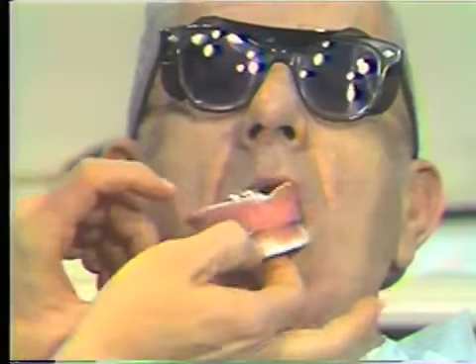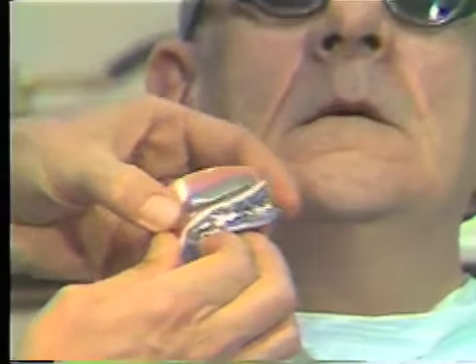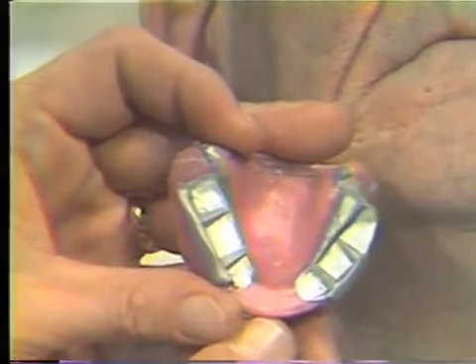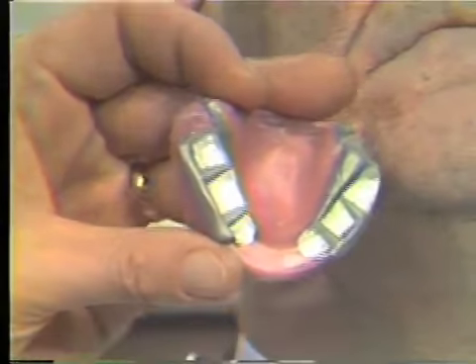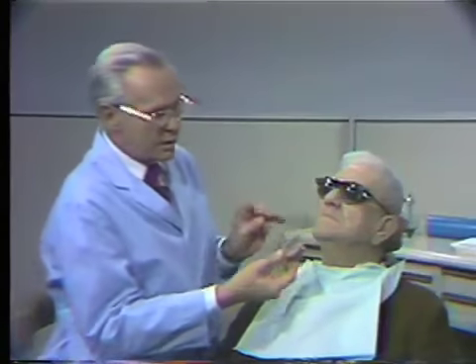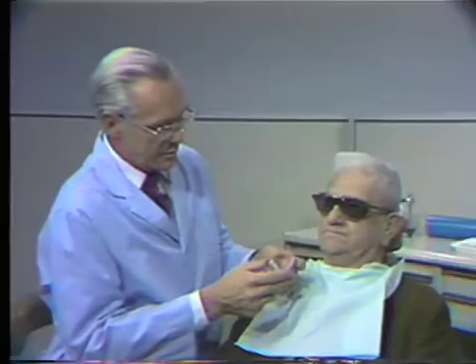And we'll remove the two rims and we'll separate them. And you can see the indentations of the grooves that we had made in our lower rim. We'll now, with this sharp knife again, cut off any excess on the buccal and on the lingual.